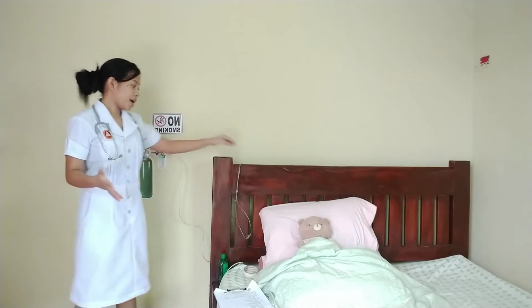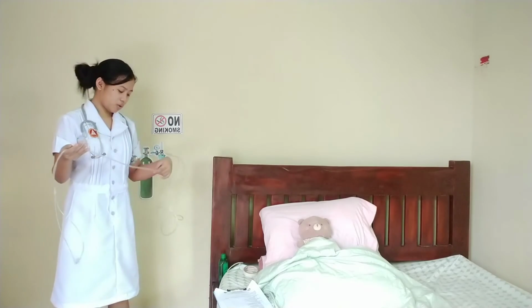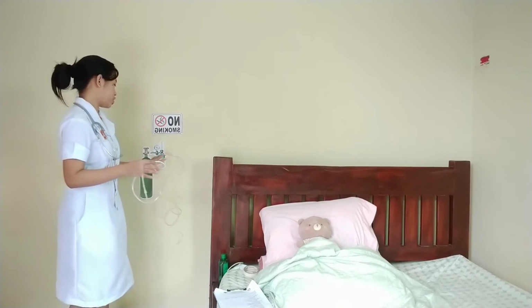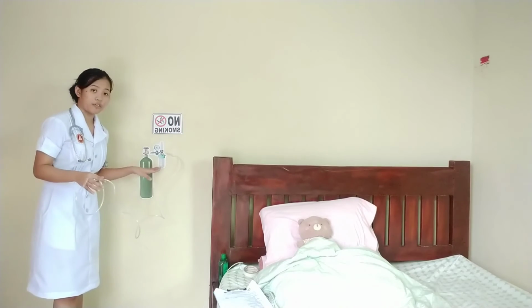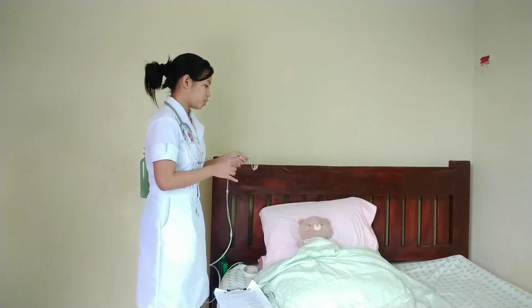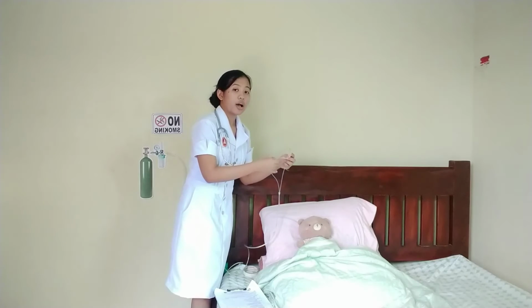And I will inspect if the oxygen is flowing appropriately to the tubing. So it is good, and there should be no kinks, and the oxygen tubing should be airtight, and there should be some bubbles when the oxygen is already flowing to the humidifier bottle. So there are bubbles. And then now I will apply the prescribed oxygen delivery device to my client. So I will be placing this cannula to the client's face.